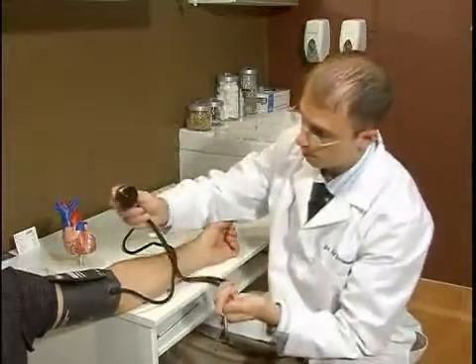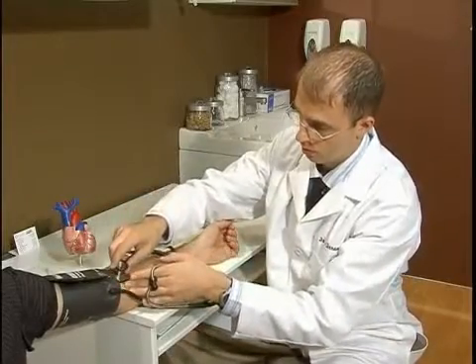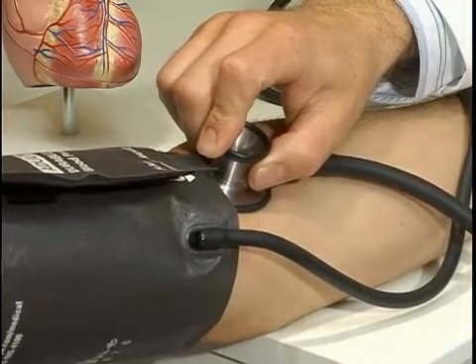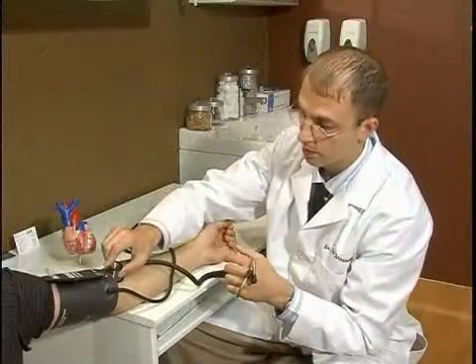The other important part is the placement of the bell of the stethoscope. You just want to put it right on that crease, or right where you find the brachial artery, which should be running right in the center of that elbow crease.